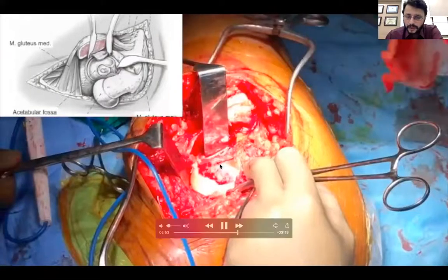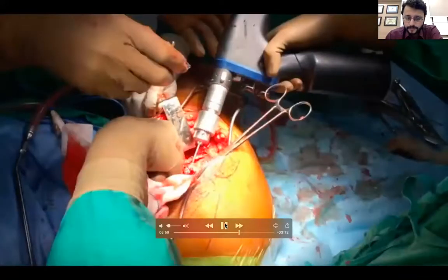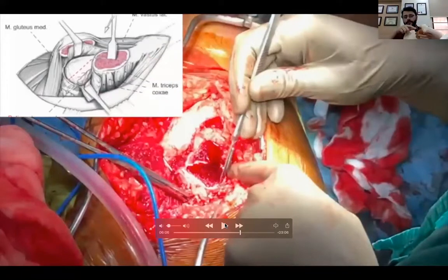And then we start creating these retinacular flaps. Now to understand what retinacular flaps are, we should know how the blood supply is. So just briefly, we have the main branch which is coming from the medial circumflex femoral artery just behind the piriformis, which is right here. And then it winds around the femoral neck, goes superiorly and inferiorly, right? So anteriorly, there's not much danger to the blood supply of the femoral neck. So what we do is we start creating these Dunn's flap and start raising it off, right?